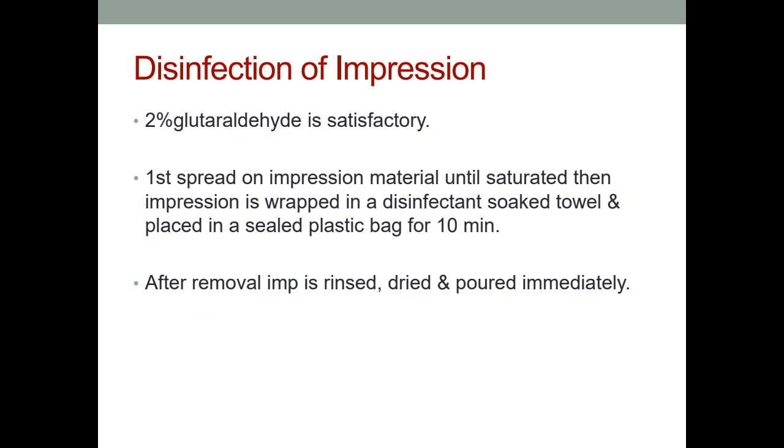Again, disinfection of the impressions. You have to see the guidelines given by the manufacturers, which disinfectant is indicated for this particular impression material. Most of the time, 2% glutaraldehyde is satisfactory for disinfection. First, spray the impression material until saturation, then wrap it in a disinfectant-soaked towel and place it in a sealed plastic bag for 10 minutes.